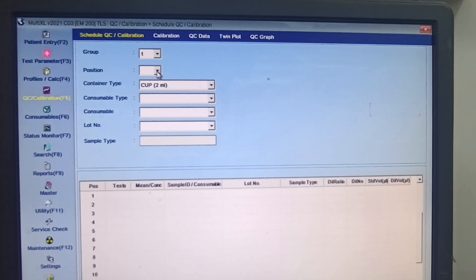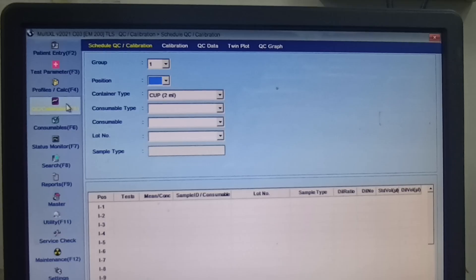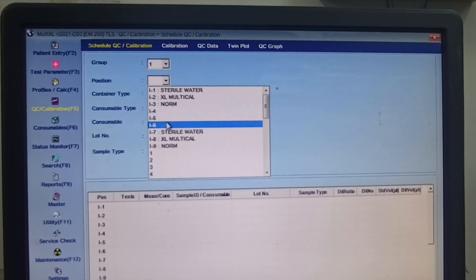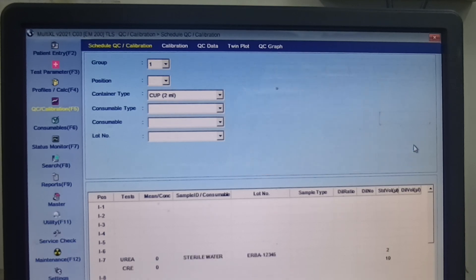If you click the drop-down button, you will see the position options. Suppose you are going to calibrate urea and creatinine — first you have to select the blank, which is sterile water, and then select the parameters: urea and creatinine. Press OK and you can see urea and creatinine highlighted here, and the sterile water is also mentioned.